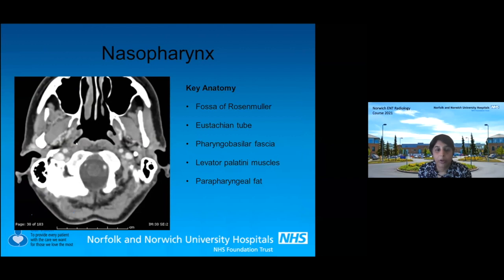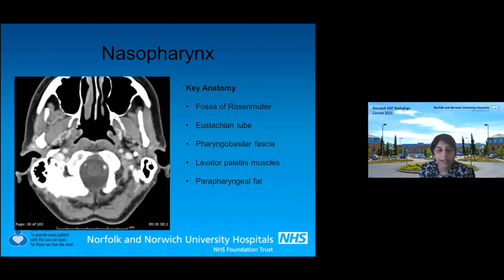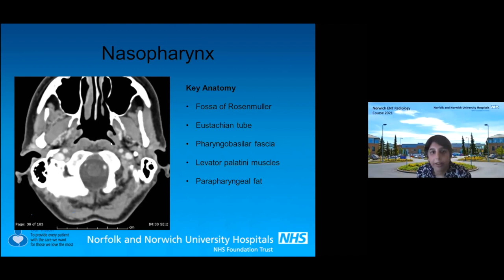The fossa of Rosenmüller is the commonest site for nasopharyngeal carcinoma, which is rare, but we've been having at least four or five cases per year in Norwich — it's gradually creeping up and it terrifies the oncologists because they don't see it often and treatment can be very tricky. The eustachian tube is this tube anteriorly. The pharyngeal basilar fascia is quite difficult to see normally, but it's the covering around the nasopharynx. It's really important in staging — if nasopharyngeal carcinoma breaks through this fascia, it can upgrade the tumor and means the patient is more at risk from nodal disease.